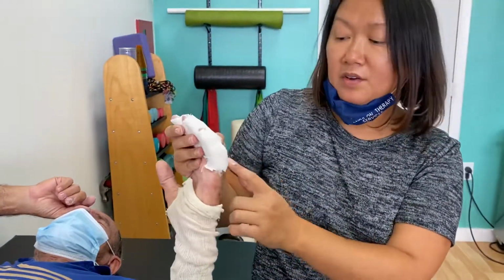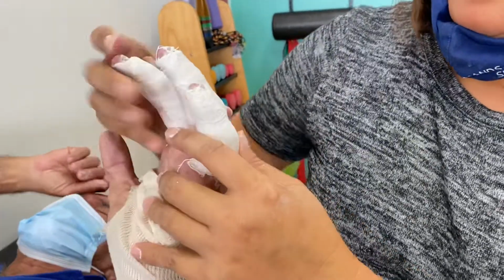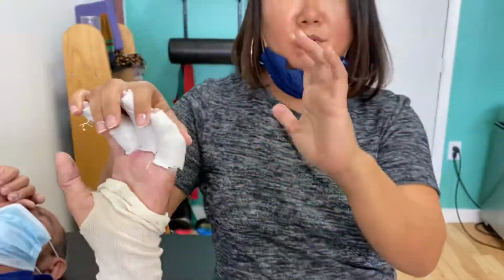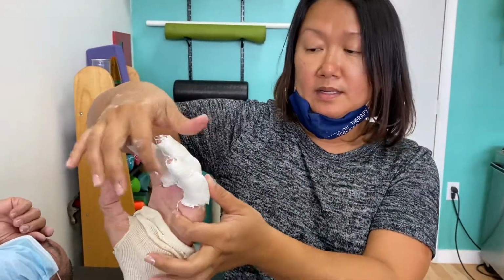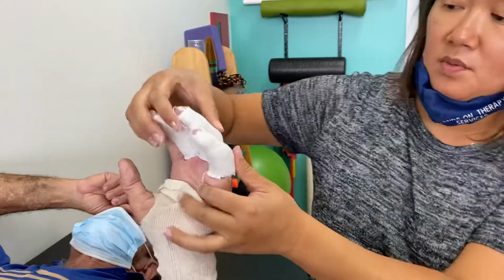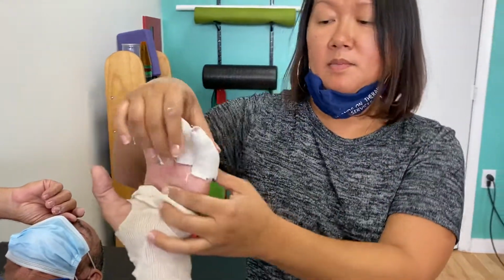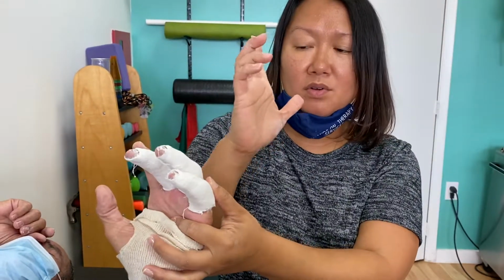So I casted his fingers. He's got the capsulectomies here and here. And his fingers, he has an ulnar nerve injury, so it was really bent. So what I do is I got as much extension as possible, which is fine. If I could just get to 30, which is where I think I am, I'm happy. I've included his IPs because they're also curled in.